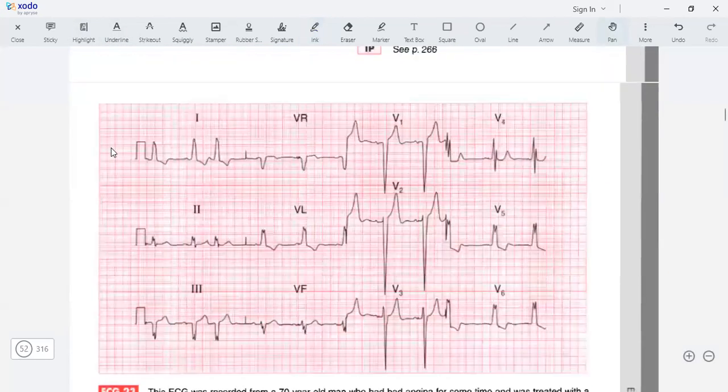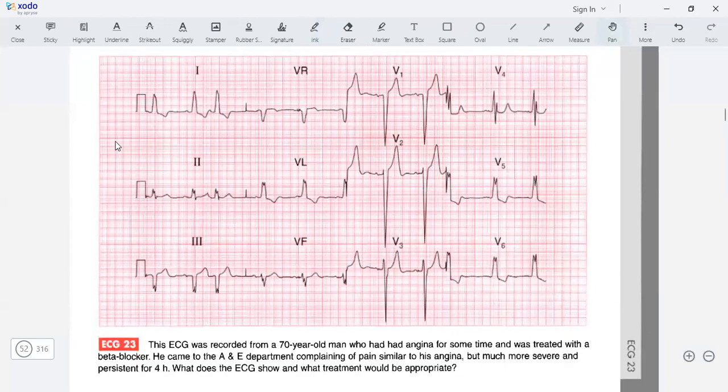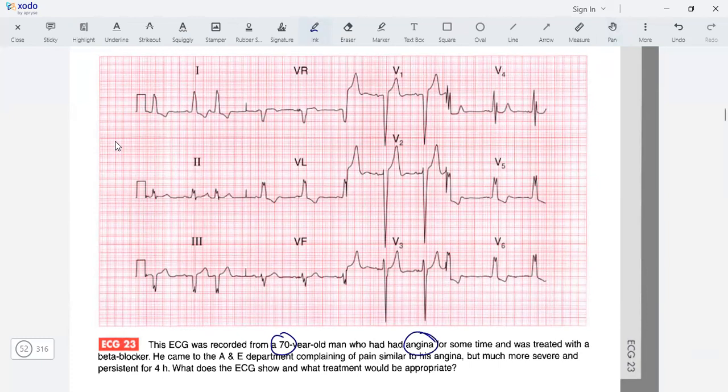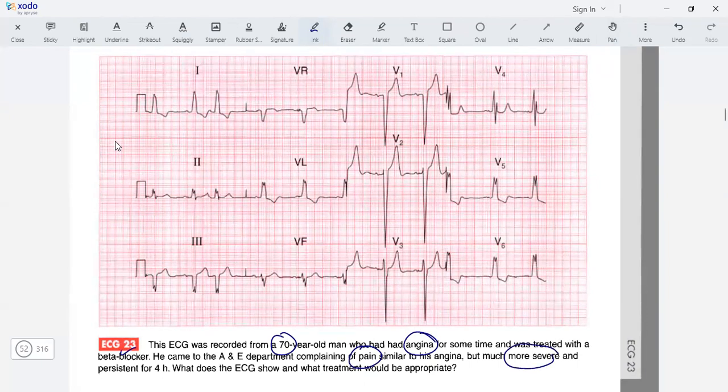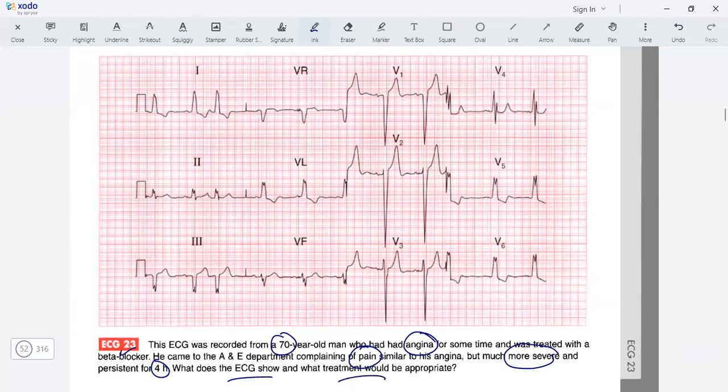Moving to the second ECG: a 70-year-old man with angina treated with a beta blocker, now with severe pain similar to angina, persistent for four hours. The rate is normal, but the rhythm seems to be irregular. Let's check out the P waves. I can see P-R, P-R, and this is a premature complex.